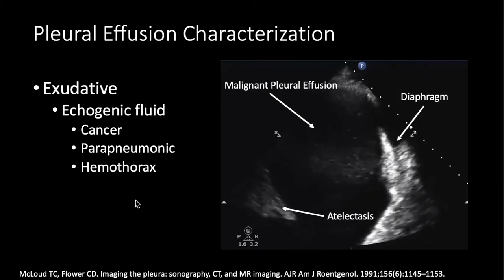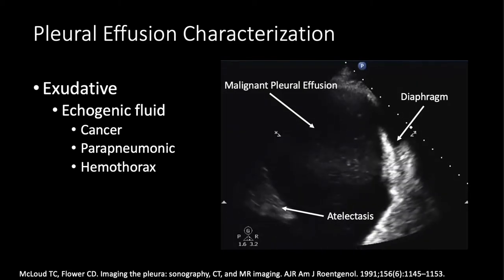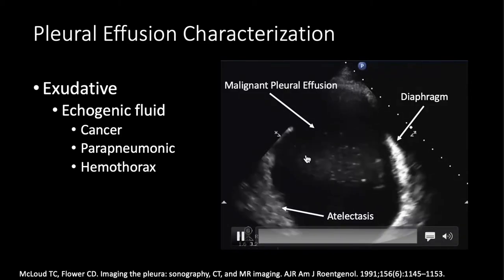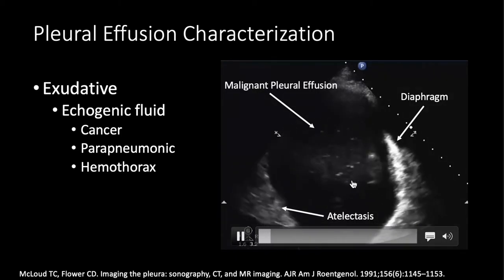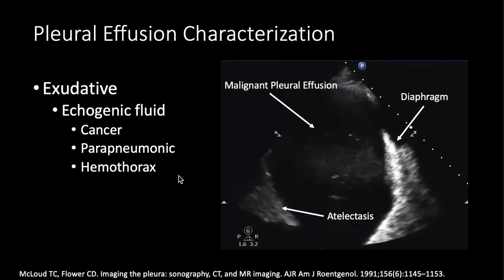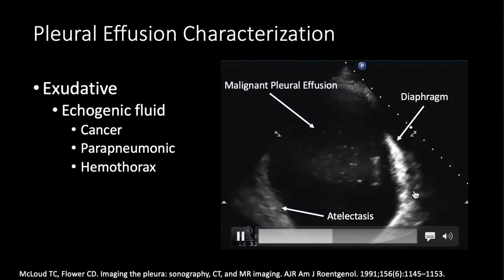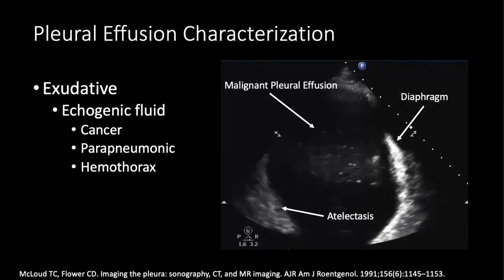Here's an example of echogenic fluid in the pleural space, indicative of an exudative pleural effusion. When you see this floating debris — sometimes called the floating plankton sign — it's due to high protein content. It's either cancer, a parapneumonic effusion, or hemothorax, again requiring a diagnostic thoracentesis. This is not due to classic CHF; it has high protein content and needs further investigation. CT cannot see this echogenic fluid — ultrasound is superior.